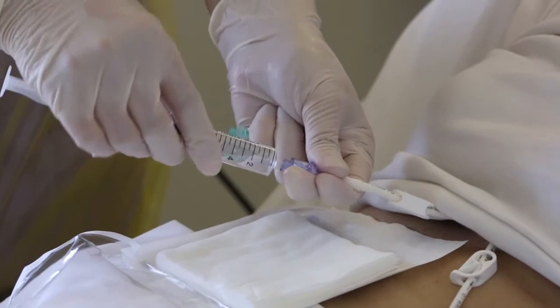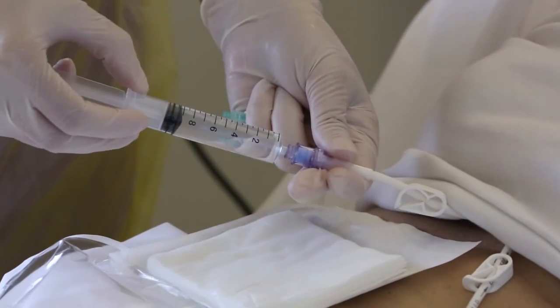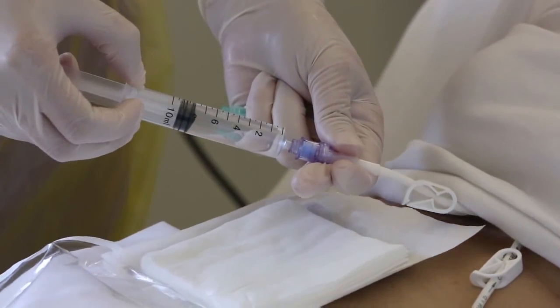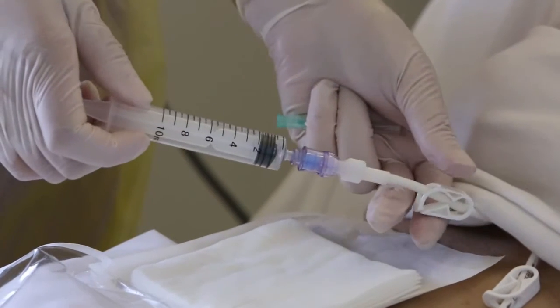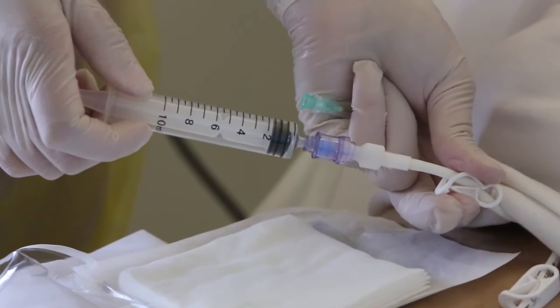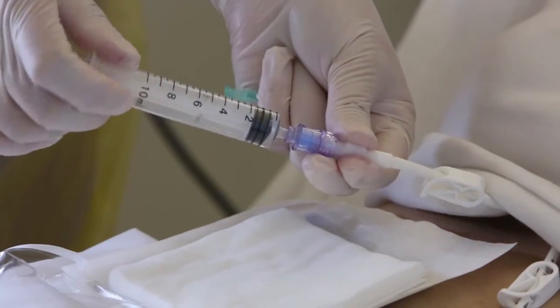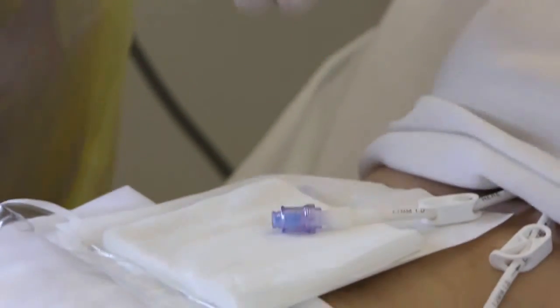Flush the line with 10 ml of saline using a push-pause method throughout the flushing process. Clamp the line whilst pushing in the last few ml of saline to create positive pressure inside the line. The second saline-filled syringe may be used if needed.